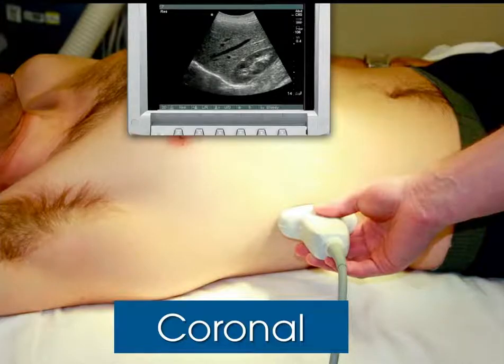Coronal is where people can get confused. Coronal also means longitudinal, like sagittal, except now we're getting a longitudinal view from the side of the body. So we've got the probe along the lateral aspect of the body, the indicators towards the patient's head, and that's why we can see the diaphragm up here superiorly, and all the way down through Morrison's pouch, we see the lower pole of the kidney inferiorly. So this is towards the feet, this is towards the head, and this is a coronal view. It's coming from the side of the body.